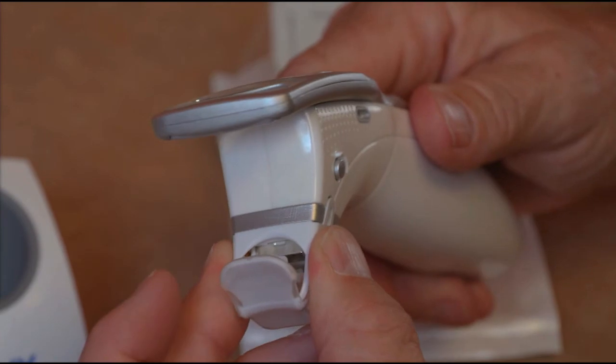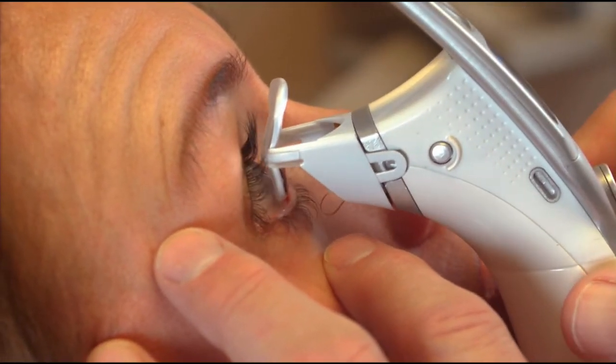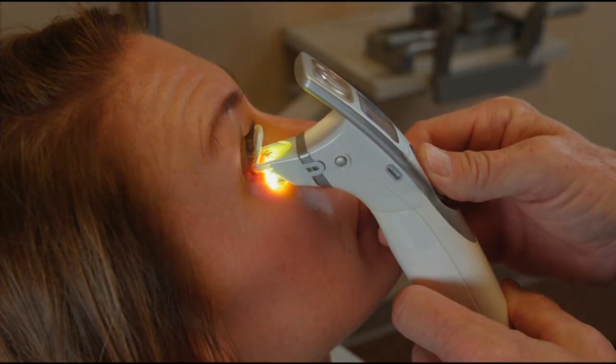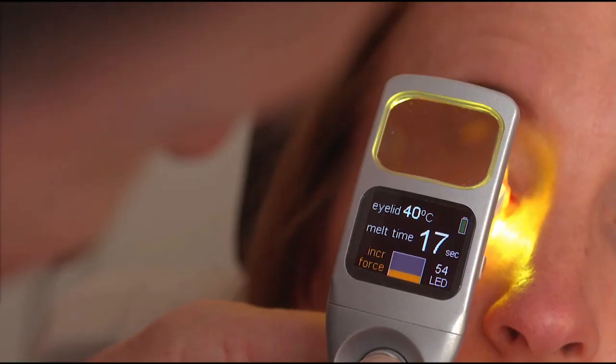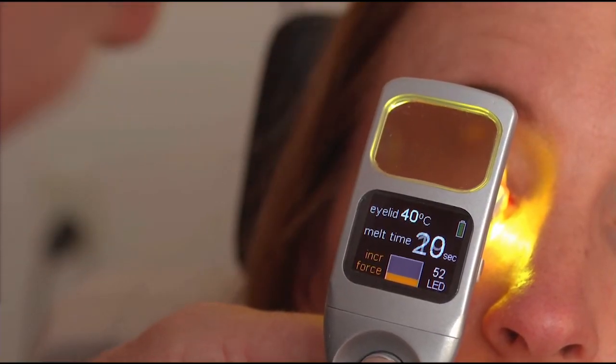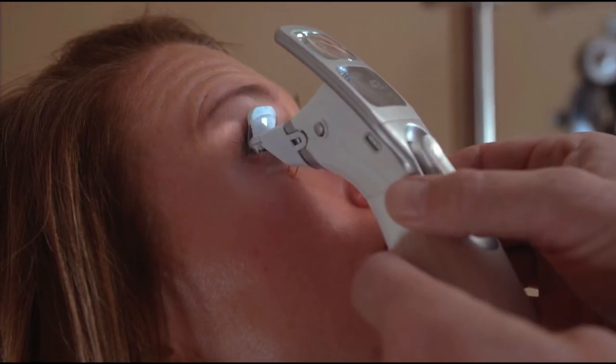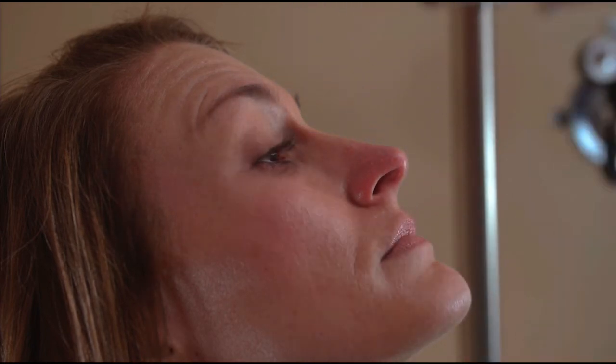This 40-second video shows the attachment, the placement of the smart tip in the lower lid, heating of the lower lid, viewing the lid margin through the magnifier and monitoring the user interface, and removing the smart tip from the lower lid.